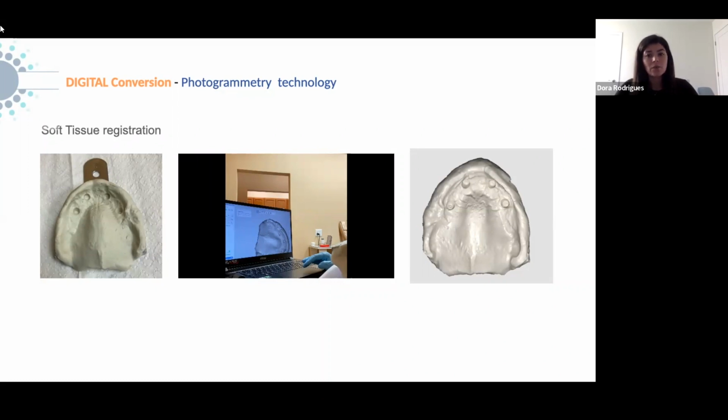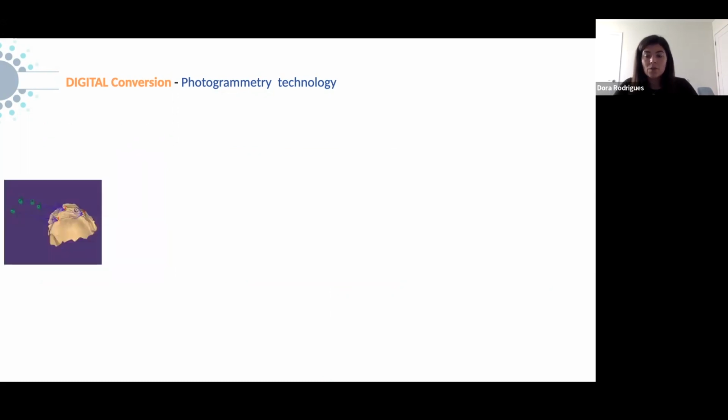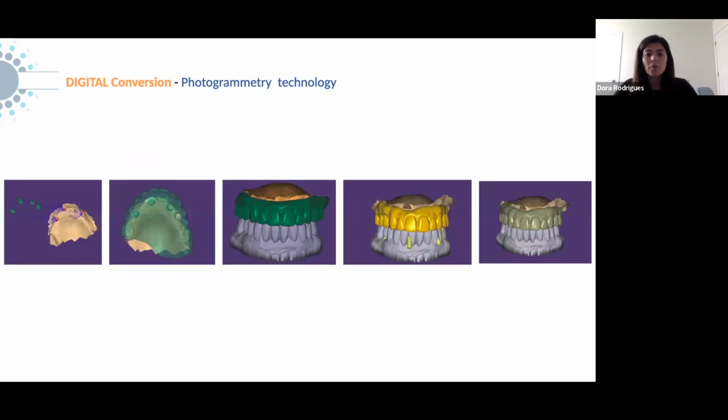So these are the two things that you need. You need your implant capture, and then you need your soft tissue so you can align one on top of the other. And then you bring it to your software and you just superimpose everything and merge all the data. There are different scan strategies to align this, and that's why I say you need to be really comfortable with designing. And whatever software or system you buy, I'm sure they will give you proper training on all the strategies that you need to learn how to merge all the data.